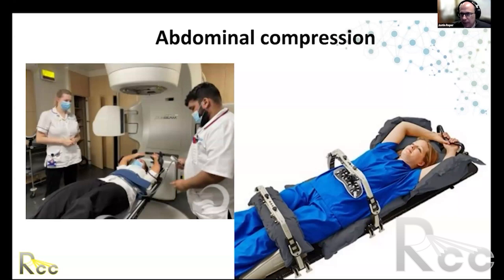Alternatively, another device, as shown at right, might be used in which there is a bridge over the patient and then a paddle that goes down. This paddle can be pressed into the diaphragm and tightened. These settings are recordable and indexable, both for the belt and for the plate.